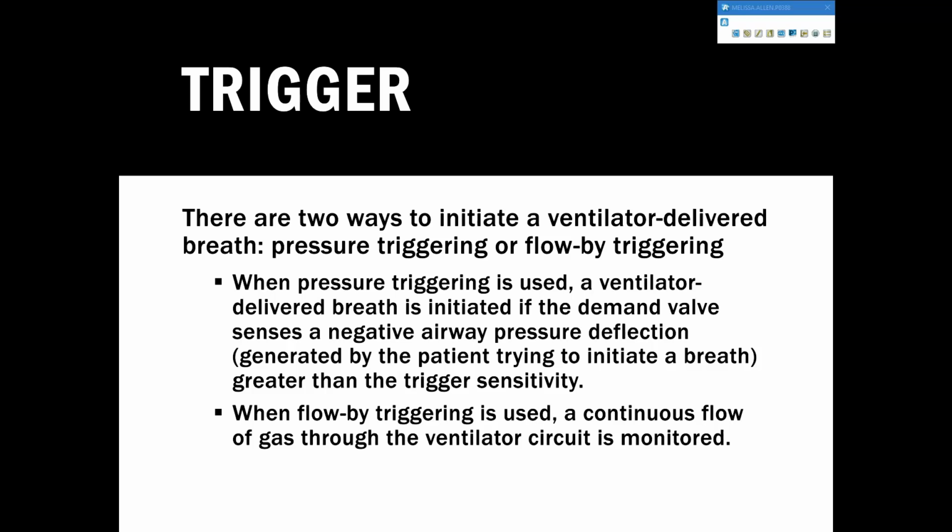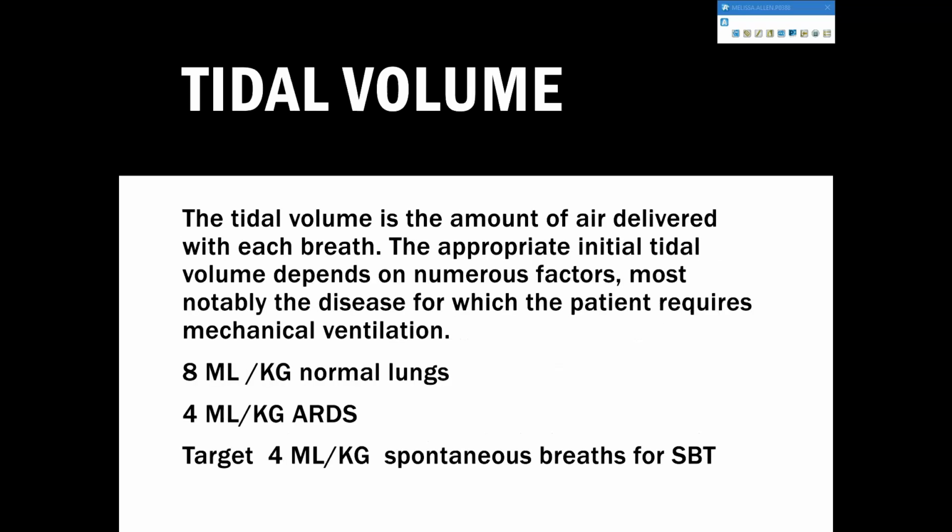In addition to the pressure triggering, you really just want to make sure that you're optimizing flow. When they're flow hungry, that can happen as well. Especially this will happen with your taller patients and younger patients as well.